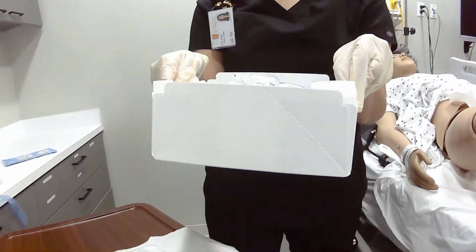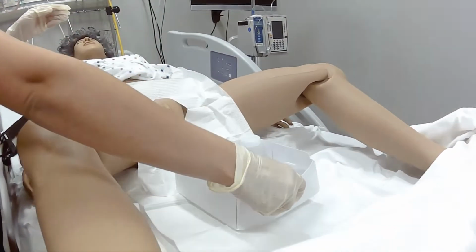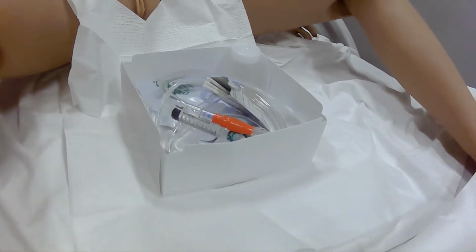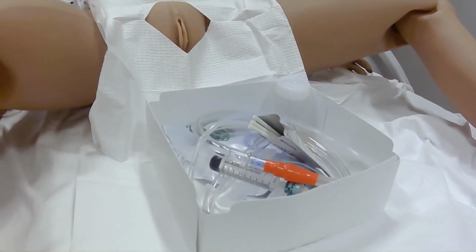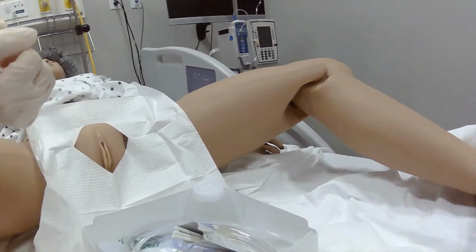Okay, so now we're going to get ready to bring this over to our sterile field. And notice how we're placing it within our sterile drape within the 1-inch margins. Again, it's an extension of our sterile field.